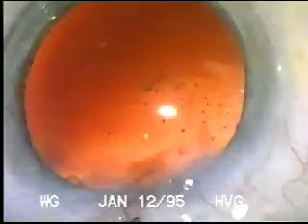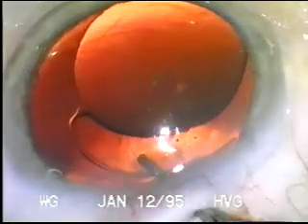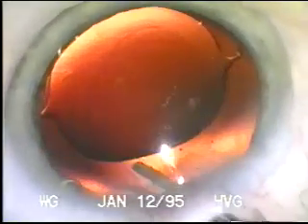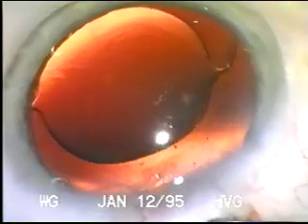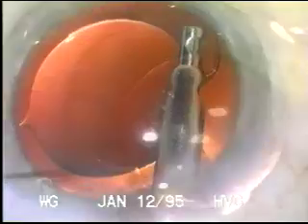Once the loop is in place, the intraocular lens is placed in the bag, viscoelastic removed, and you will find that these lenses center very well with no evidence of the previous zonular dialysis. The vitrector is used to check for any herniating vitreous and the pupil is constricted.